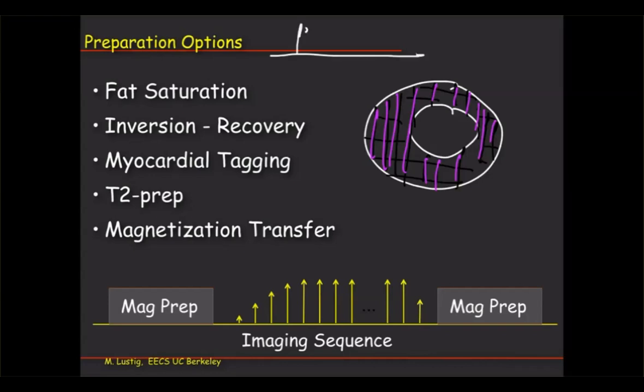So what you could do is a sequence like this. You do a 90, and then you wait, and then you do a minus 90. Okay, what happens there? You excite magnetization. Magnetization then starts decaying with T2, and then you put it back into MZ.